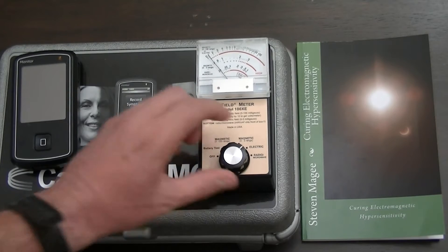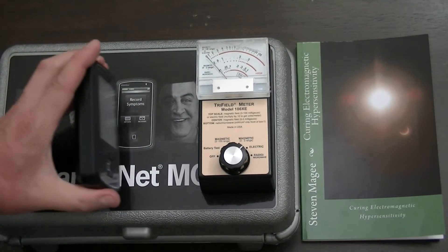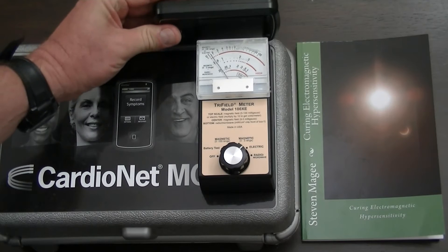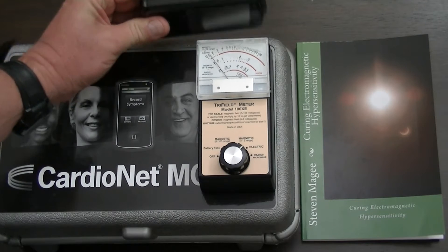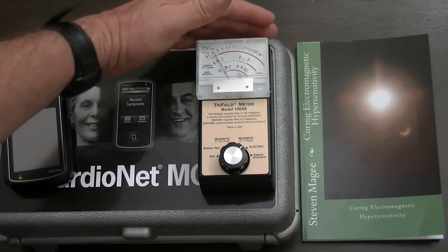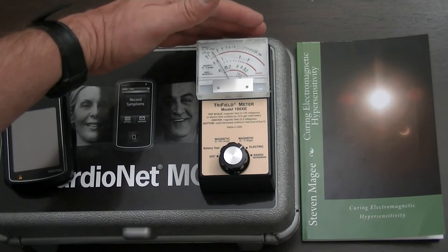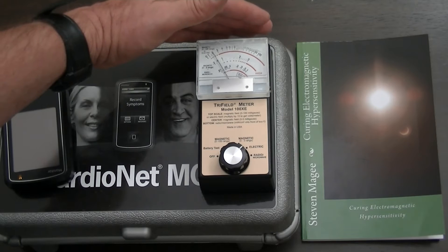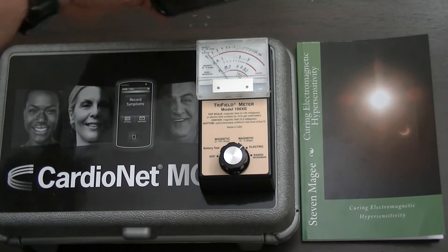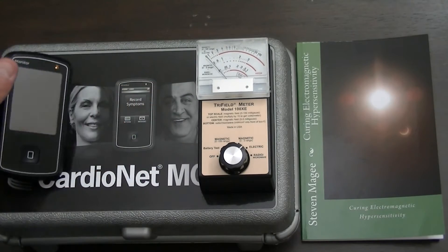Let's try the electric field setting. The electric field setting is not really picking up much unless it's really close. Sometimes you have to determine whether it's you or the device, because the operator's own body has an electric field, and when you get close to the meter it picks up on that. So it's probably not emitting an electromagnetic electric field as far as I can tell.